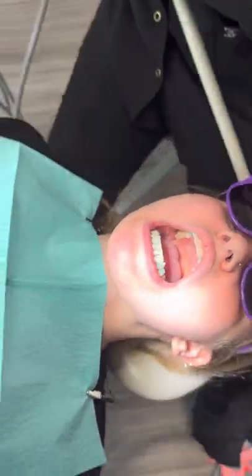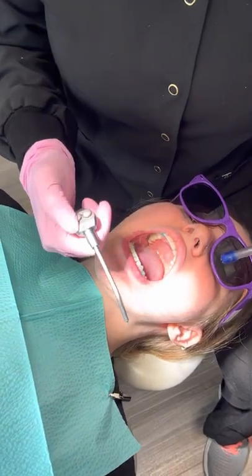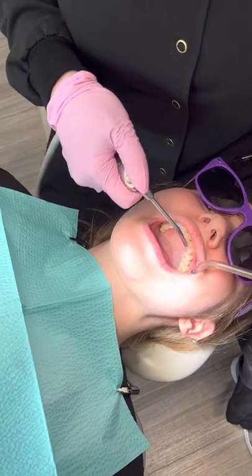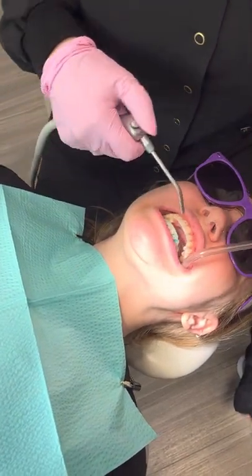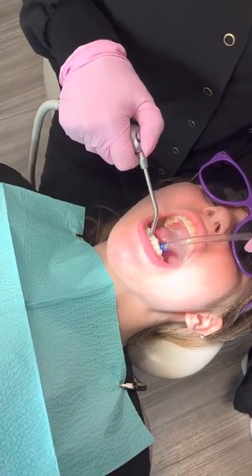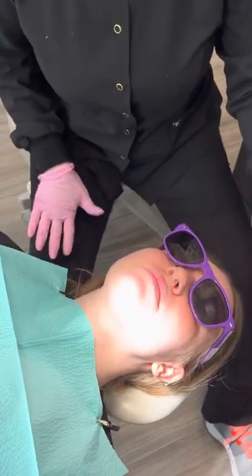Now that your prophy is complete, place down the handpiece and take your air-water tip. The left side is going to be the water, so the right is going to be air. Using this, retract the cheek and go ahead and spray at the buccal surface, slowly retracting with the suction. Repeat the same on the other side, asking the patient to stay open, then on the bottom, and go ahead and close. A tip: when you have your patient close, step back because sometimes their saliva will spill down onto your leg.